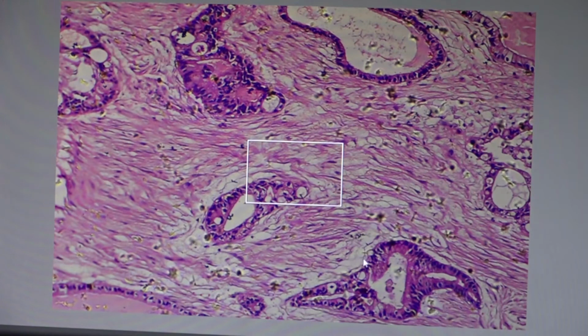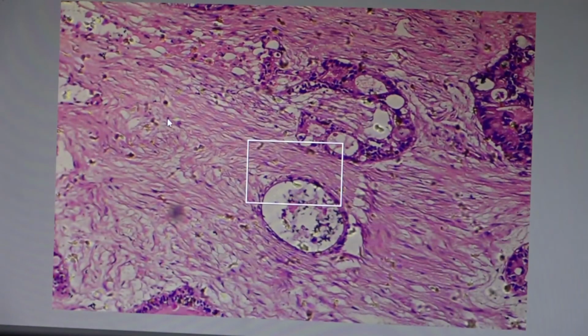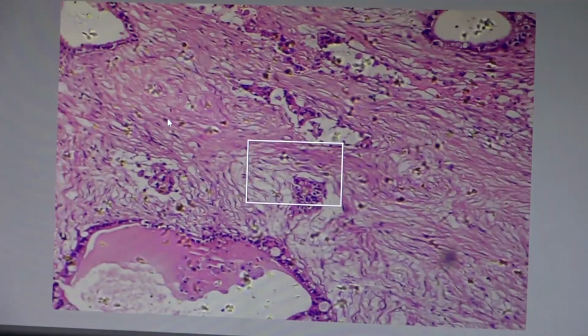Sometimes abnormal mitosis. So this is the adenocarcinoma of the malignant neoplastic cells with the features of malignancy: atypia, hyperchromatism, pleomorphism, mitosis. This is the adenocarcinoma of the endometrium invading the myometrium. Please search for other sites on this slide to see the morphology of the adenocarcinoma.